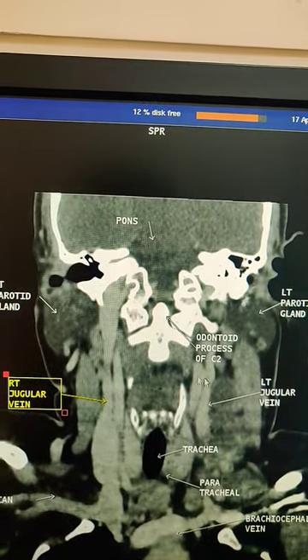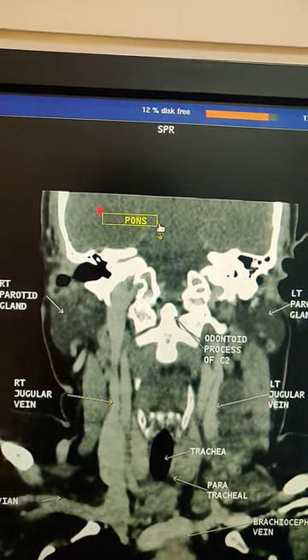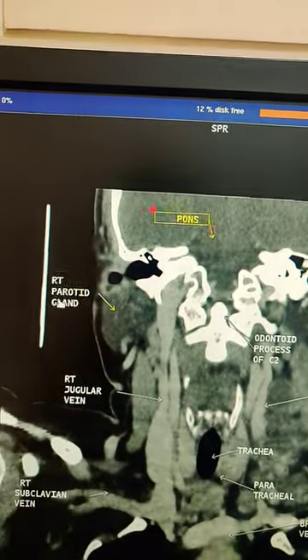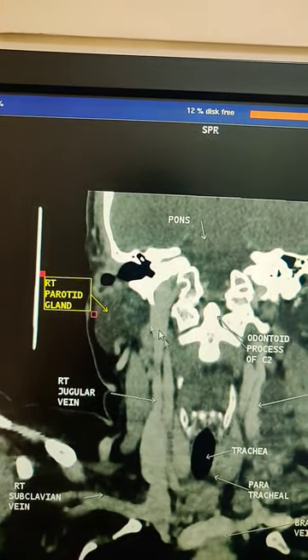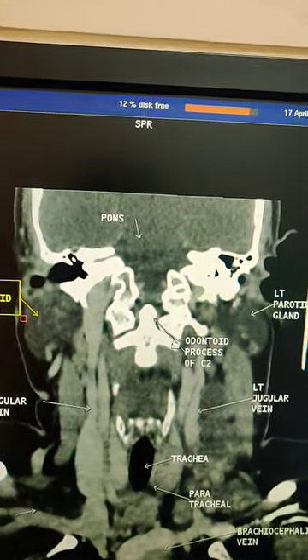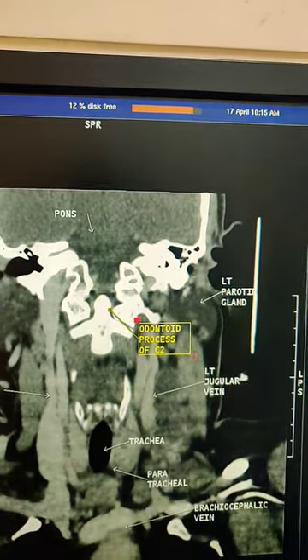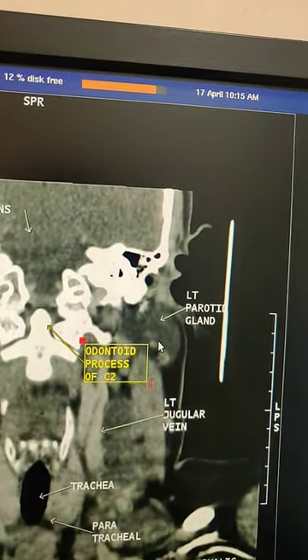We are on the CT neck. This is the pons area. Right parotid gland. Odontoid process of C2. Left parotid gland.